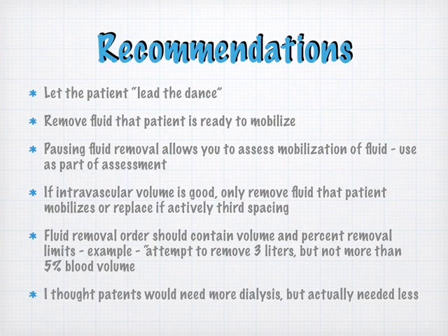I felt like my job was to assess their intravascular volume. If I liked where it was at, then my job throughout the run was to either give fluid or take away fluid and leave them at that same intravascular volume. Sometimes that meant I gave 2 liters, sometimes that meant I took off 5 liters, because the patient was the one who was deciding whether or not I gave or took away fluid.